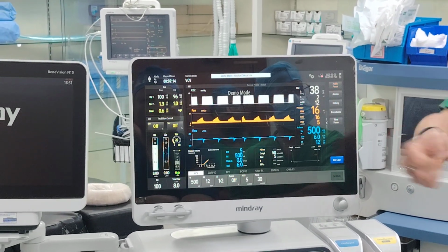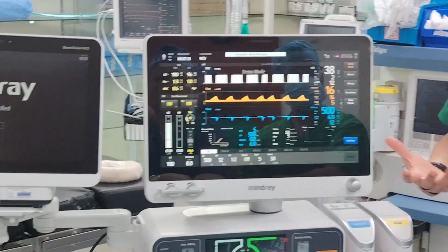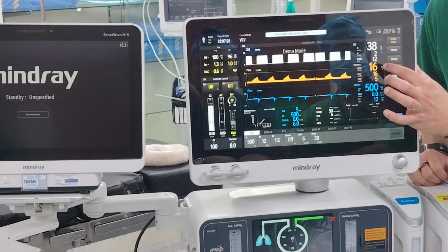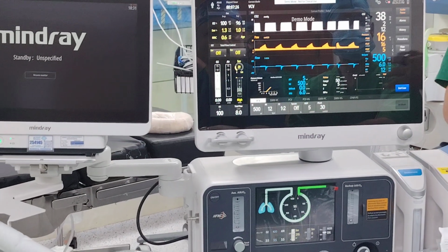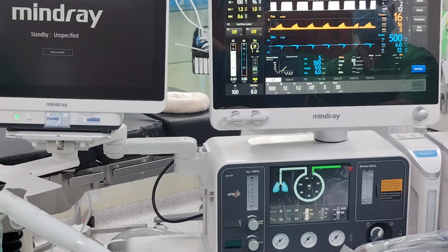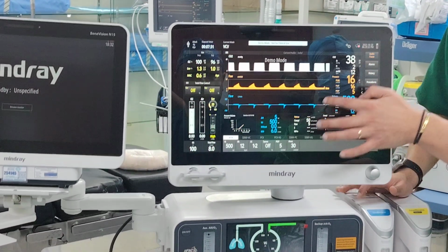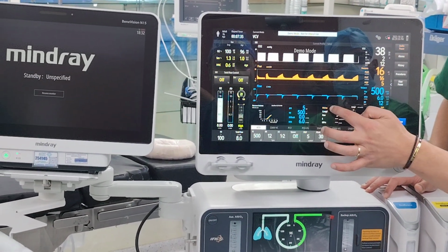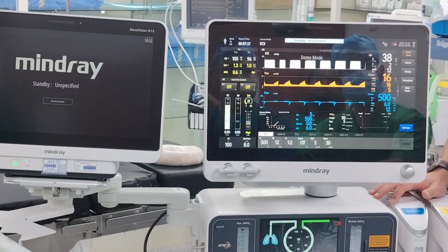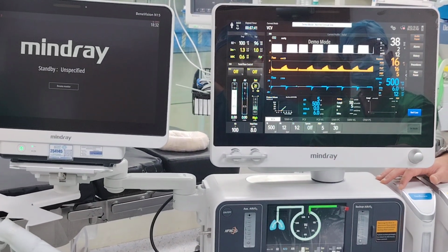The more you punch the lung, the higher the damage is, right? Because positive pressure is good, too much is bad, right? So instead of only looking at peak pressure and compliance, which you do day to day to know the condition of the patient, if it's good or bad, these two are a more comprehensive way. And I can share studies with you later on. The threshold and the limit: above 15 is not so good, it's linked to mortality rate. Above 17 here is also linked to mortality rate.